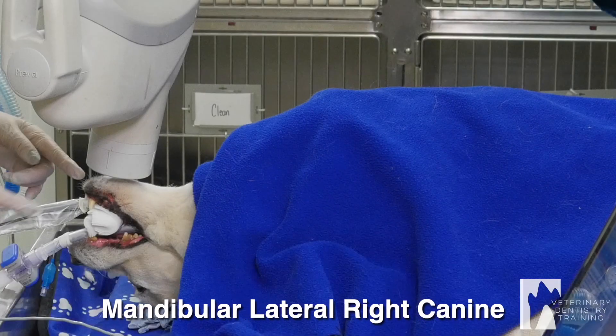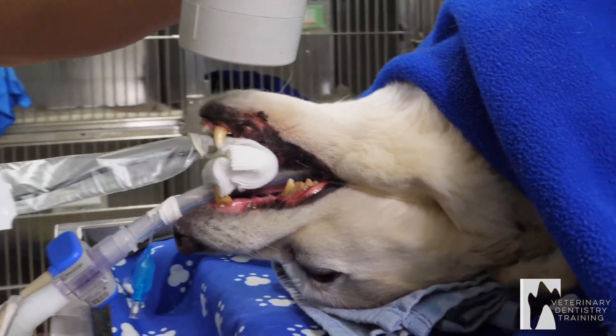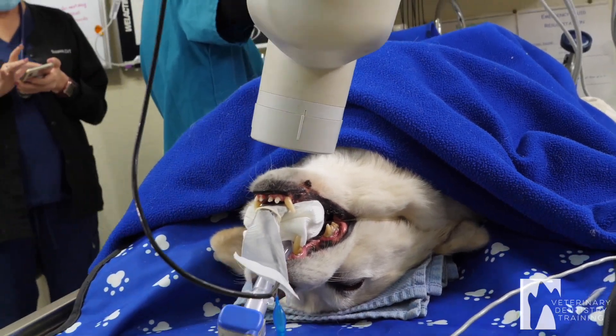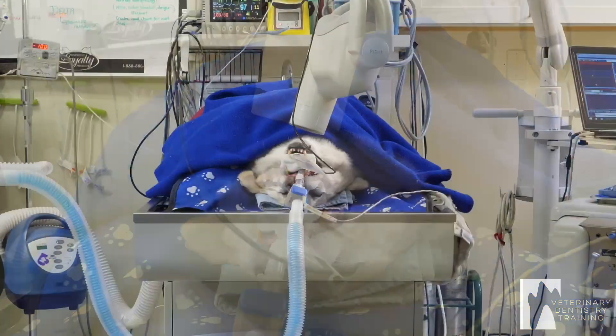Now I'm going to do a lateral right canine. I leave the sensor where it is and I just come from the side a little bit. I'm going to x-ray.